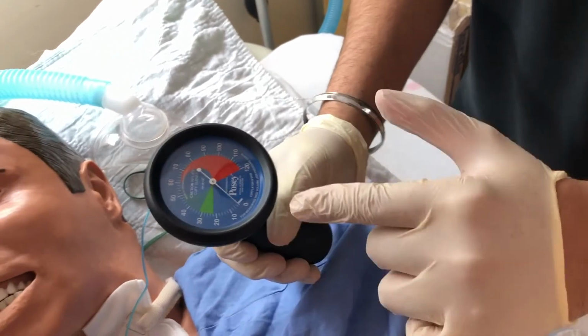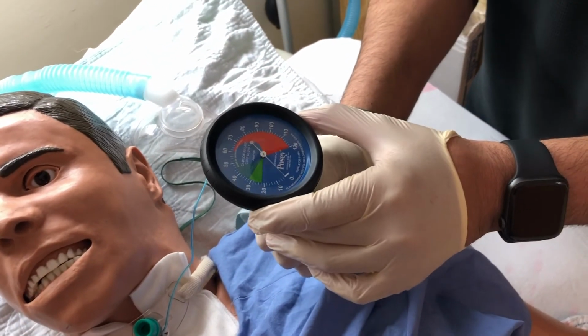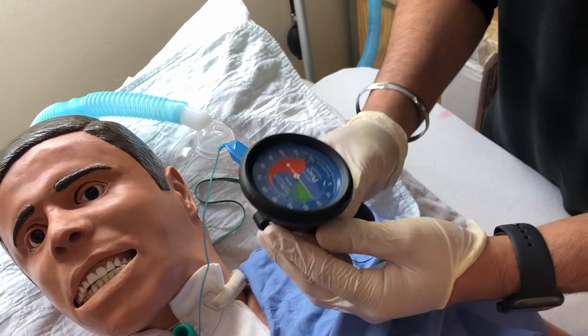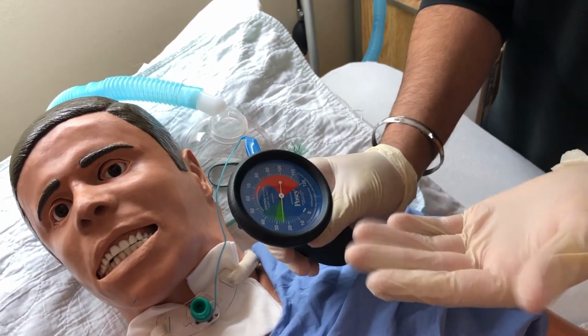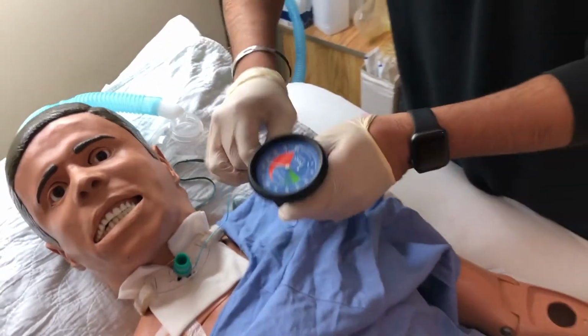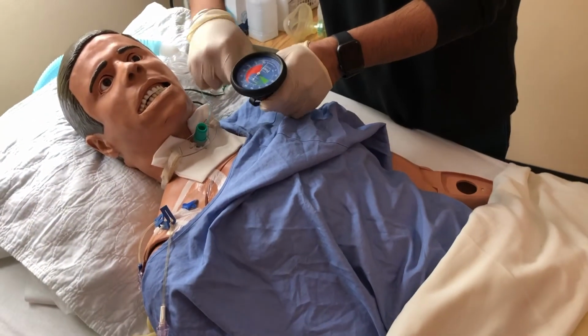So we see that it's less than the 20 to 30, so we can increase it, or that was too much. So there we go, it's between the 20 to 30 mark there. So we can close this. And our pump is beeping.